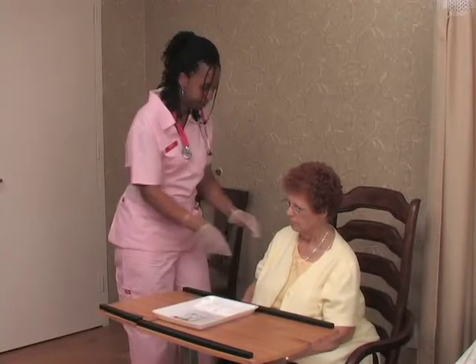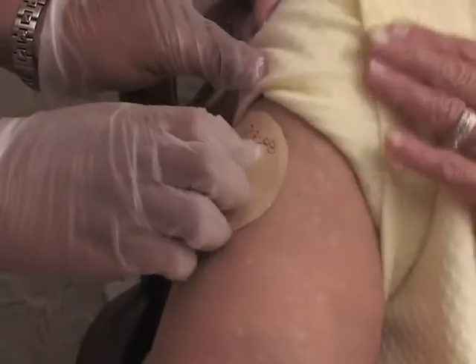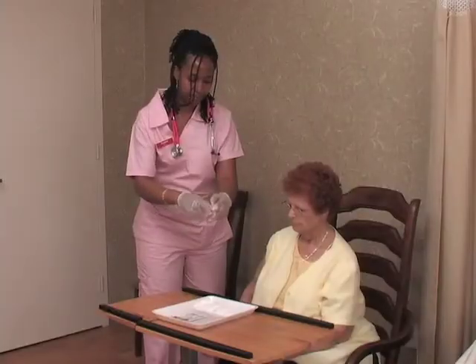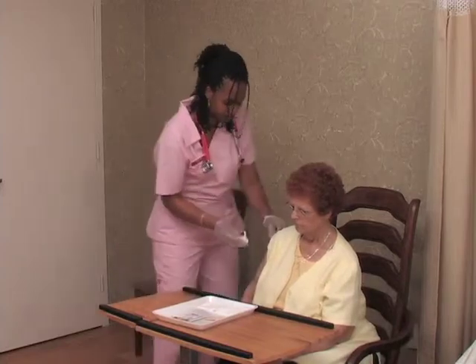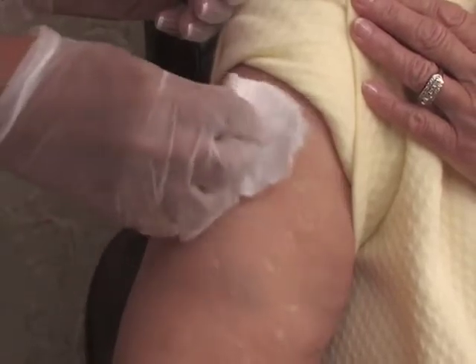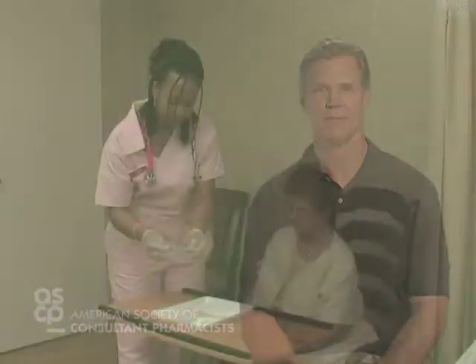The nurse moistens the gauze, explains the procedure to Mrs. Manfrey, and applies gloves. If the previously applied patch is still in place, she removes it and folds the used patch in half, placing adhesive sides together. The area is cleansed with one of the plain water gauze to prevent any additional absorption of the medication. The site of the new patch is cleansed with the other clear water gauze and pat dried.